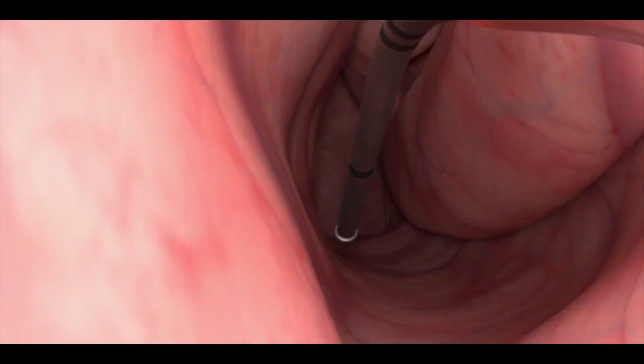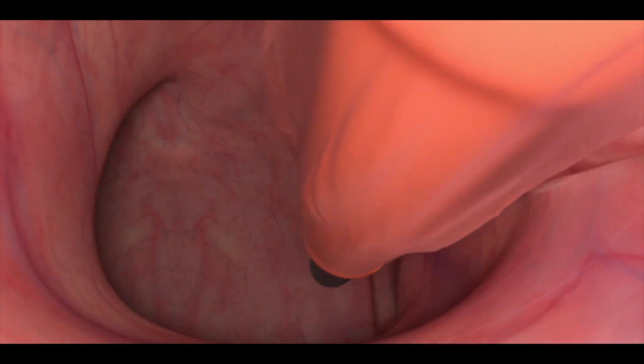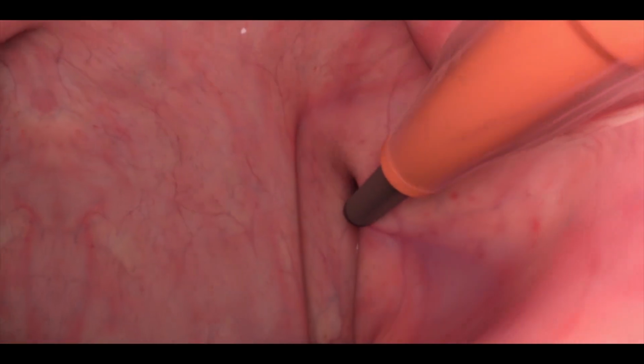The symptoms that you feel are similar to when you're on an airplane and your ears get clogged and don't open up completely, and you can have that clogged sensation that can last for a long period of time. Typically that can be treated with a number of different techniques, either medical management with things such as nasal steroid sprays, or you can also consider surgical intervention such as a Eustachian tube balloon dilation. This is when you utilize a balloon that goes right into the nasal cavity and opens up the ear from the inside to allow more space for it to drain.